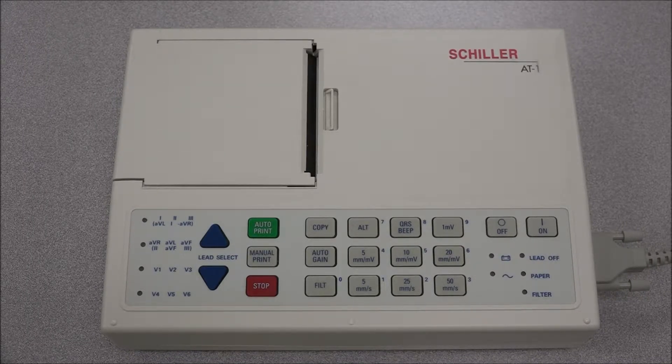In order to turn on the ECG, press the on button. When the ECG is connected, the mains light will be lit. If the ECG is running on battery power, the battery light turns on and starts blinking when the battery capacity begins to run low.